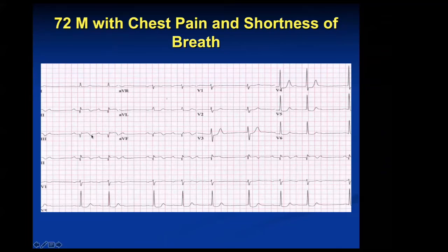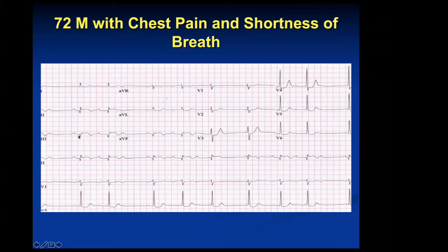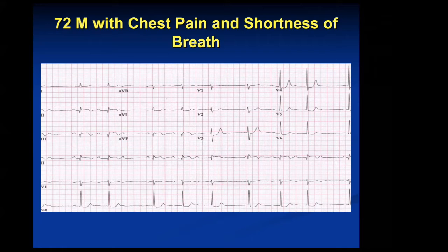That's why it's so important to go from the TP — that's your isoelectric baseline. I'm not using the PR because that can be depressed in things like pericarditis. So you use the TP as your isoelectric baseline, and then you see there's clear elevation. You have Q waves, ST elevations, and T-wave inversions — this is an evolving inferior ST elevation MI, clearly not brand new.